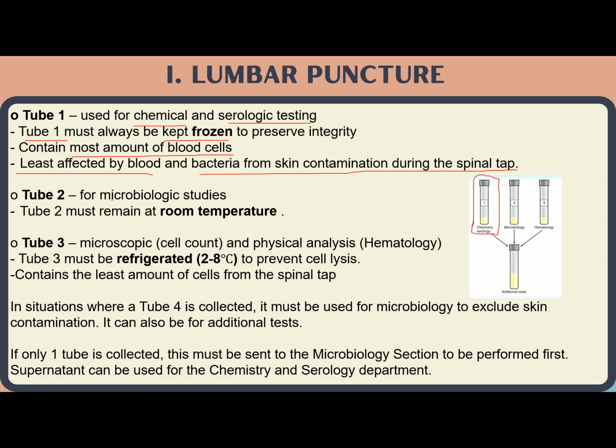For tube 2 naman, class, this is done for microbiological studies. To simplify, tube 2 is for microbiology testing or bacteriology testing. Tube 2, class, please take note, must remain at room temp.